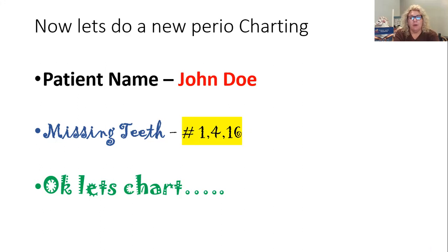So we're going to go up the paper to the lingual, distal lingual of 17. Everybody ready? Distal lingual 17. 4, 4, 4, 4, 3, 3, 3. Where am I? Everybody should have said mid or middle lingual 19. 3, 3, 3, 2, 3, 3, 2, 3.